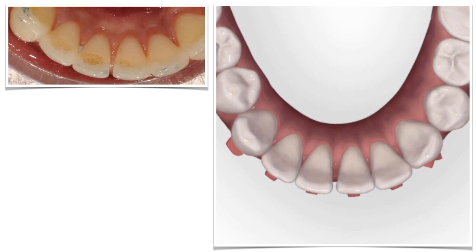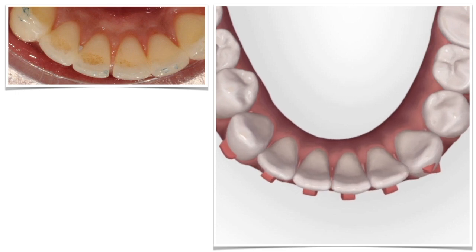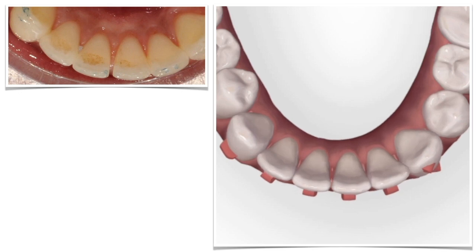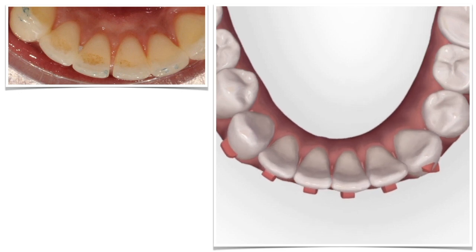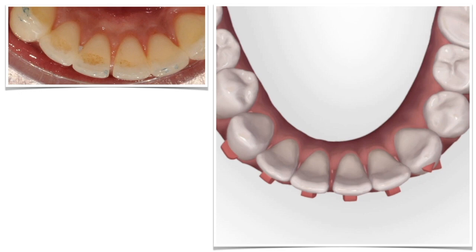At this point, we just take new impressions and start the refinement to close the space. We don't need any more IPR here because we already have an excess of space. The software will just automatically retract those teeth until that space is closed. You can also place some attachments on those incisors to make sure the teeth follow the aligner well.